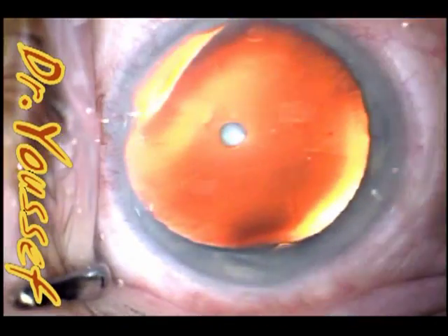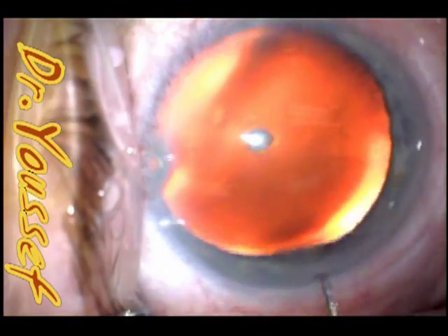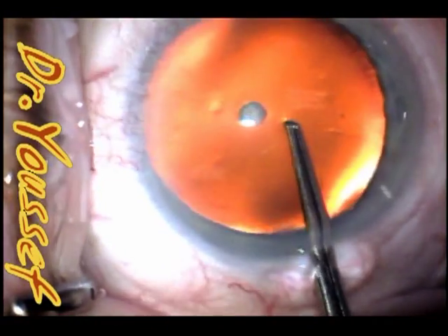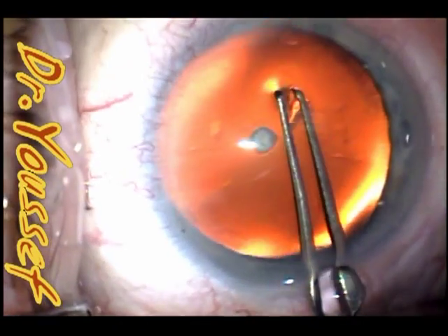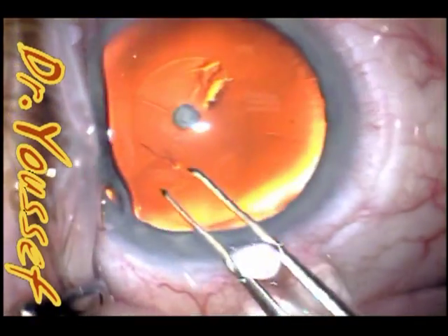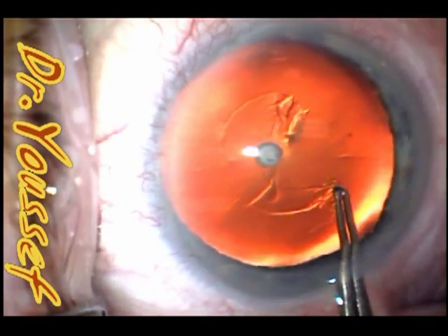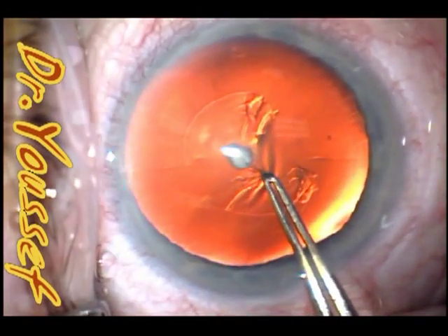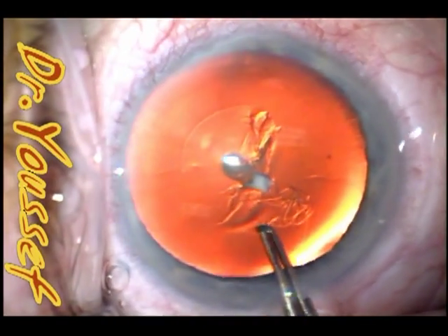Just the routine steps here. When I started the capsulorexis, I tried to start a little bit further away from the anterior pole cataract and just include it in the flap — going around it. The flap itself is being torn around that, and you can see it's going around and coming off with the capsule.